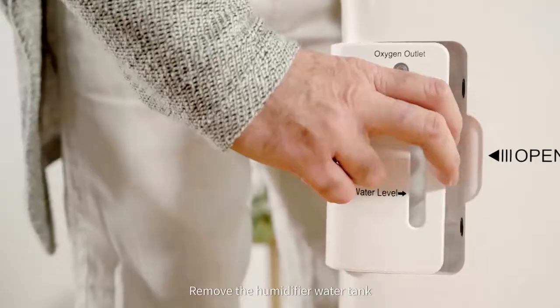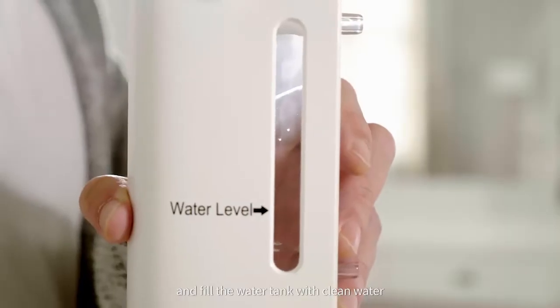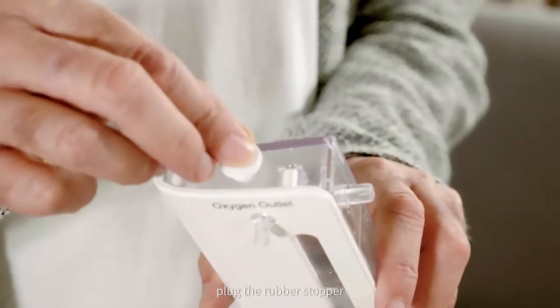Remove the humidifier water tank. Open the rubber stopper and fill the water tank with clean water, not exceeding the highest water level. Plug the rubber stopper.